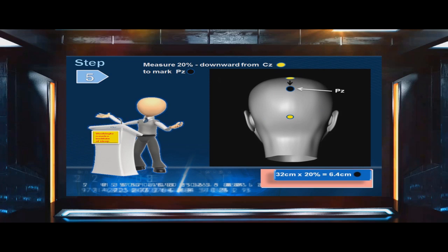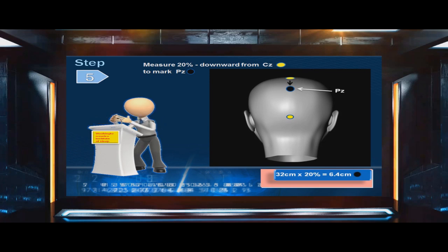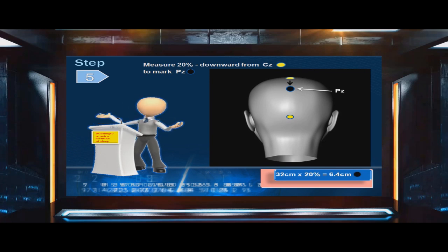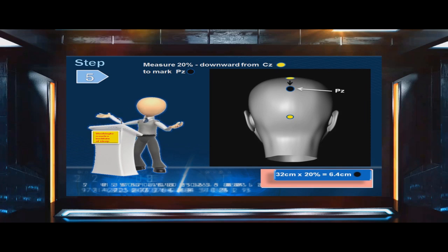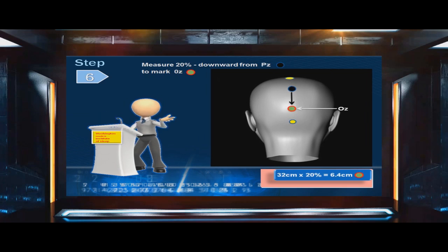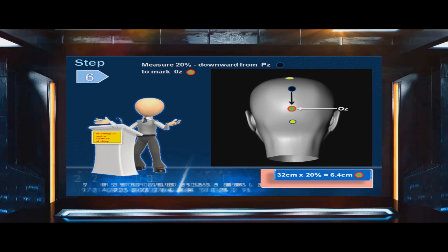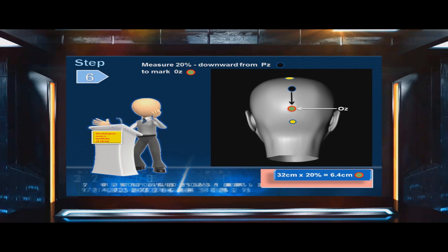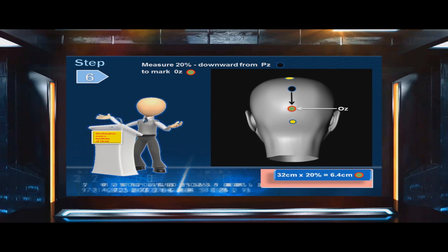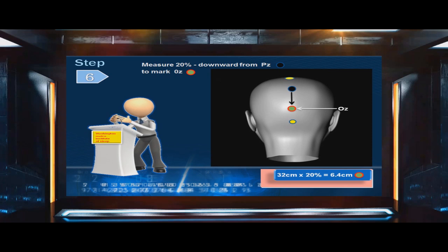Step 5: Measure 20% downward from landmark CZ to mark PZ. In this example, 32 centimeters times 20% equals 6.4 centimeters. Step 6: Mark 20% downward from PZ to mark OZ. In this example, 32 centimeters times 20% equals 6.4 centimeters.